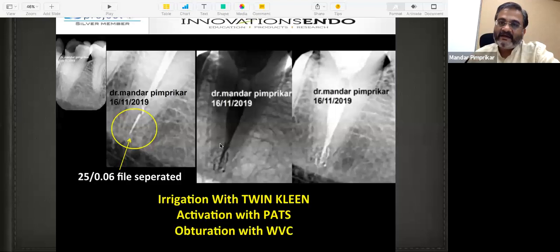You can still try, disinfect the root canal space completely and obturate it. Keep the tooth under observation. Make the patient informed about it. Don't hide anything from the patient.